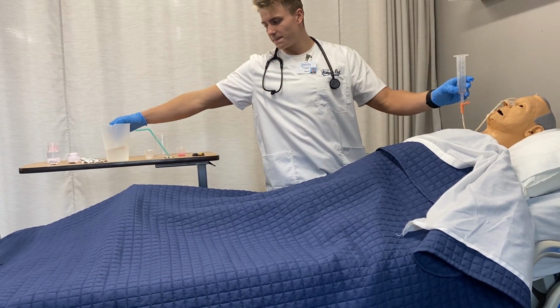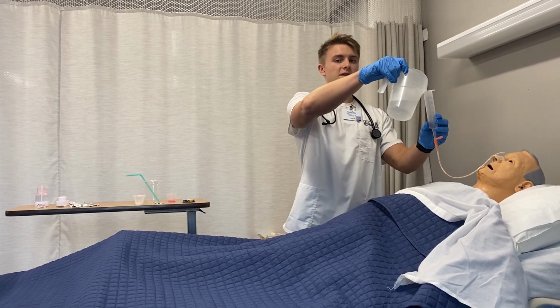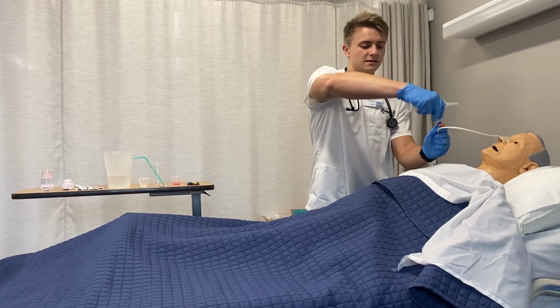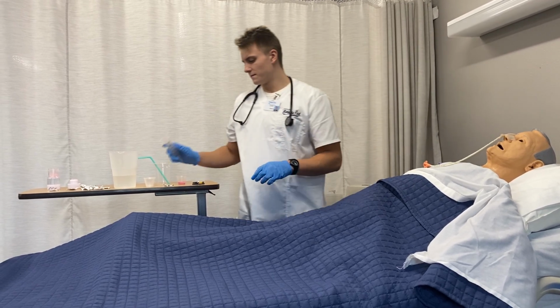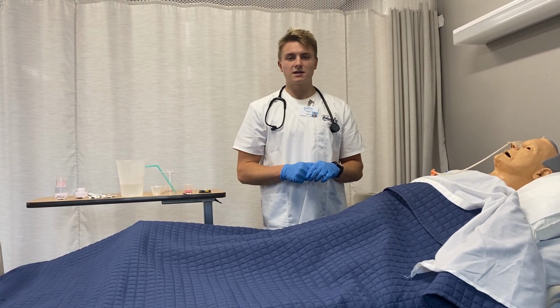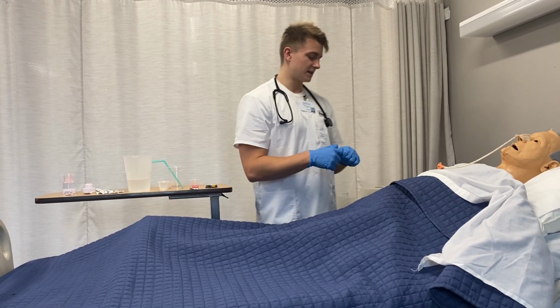And if I need to administer another medication, I would do 5 to 10 milliliters of water before the administration of the second medication. If not, I will flush it completely with 30 to 60 milliliters of water. Now that the medication is flushed, I'm going to pinch, I'm going to disconnect, I'm going to replunge the tube. Before I would administer the medication, I would check the packaging of the medication and make sure, once or for the third and final time, that it is the right medication to give the client at that specific time and with that specific route.